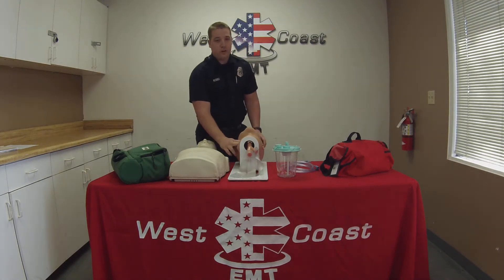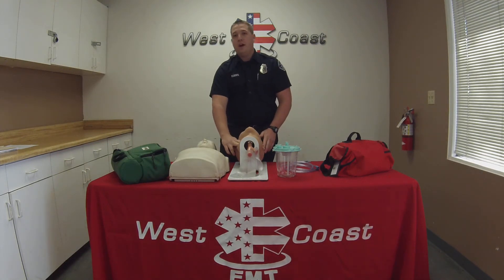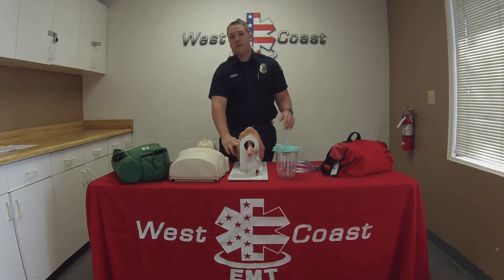I'm going to go ahead and check for a carotid pulse, at least 5, no longer than 10 seconds. I'm also going to call for additional resources. You palpate a weak carotid pulse at a rate of 60.